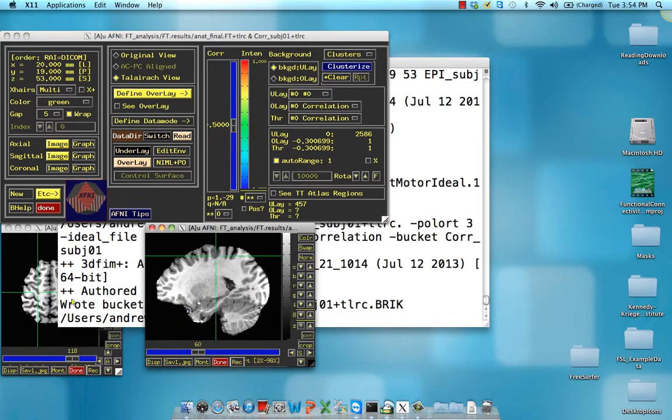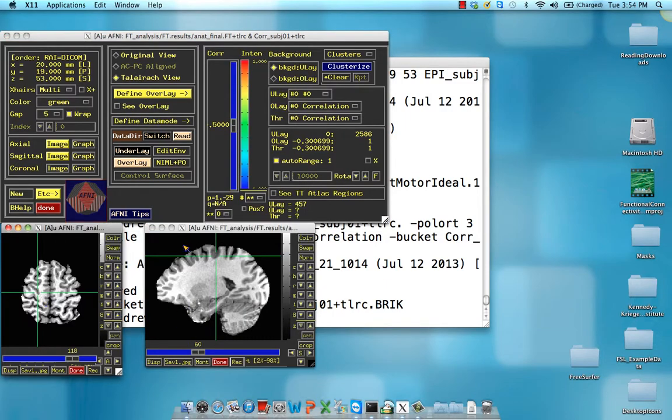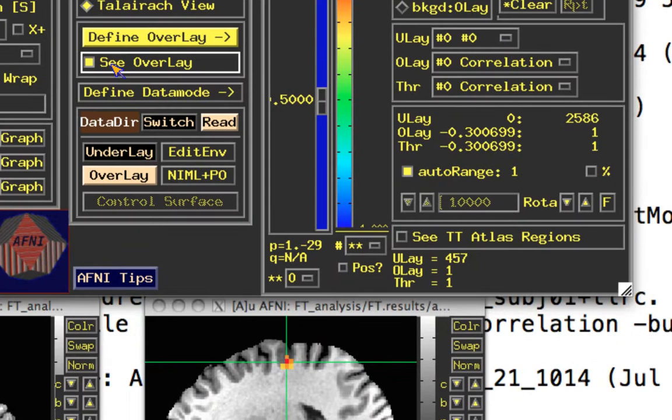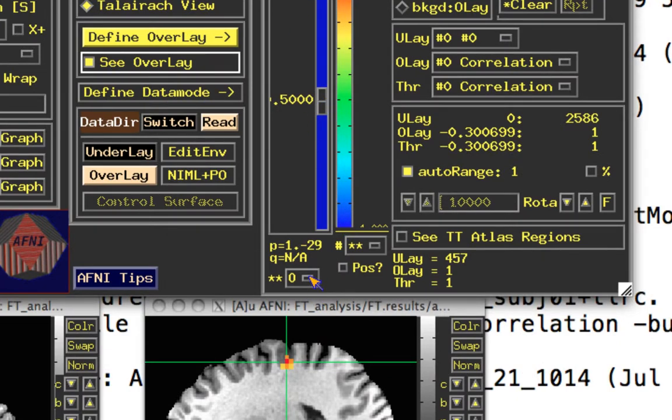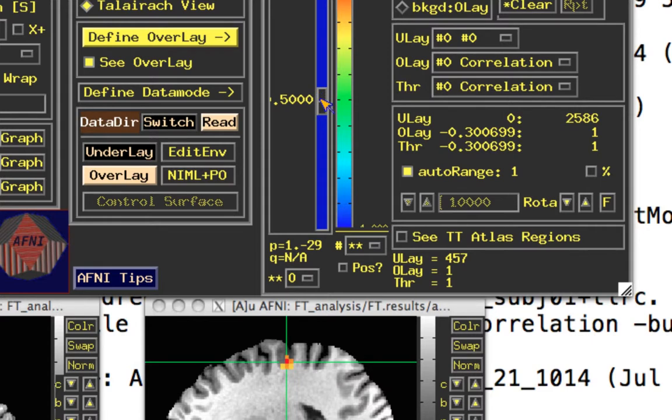Great. So now what we have in this slider right here, also make sure the overlay is on, is correlation threshold. So make sure that this magnitude is at zero because if you go above one, then obviously you can't have a correlation greater than one.